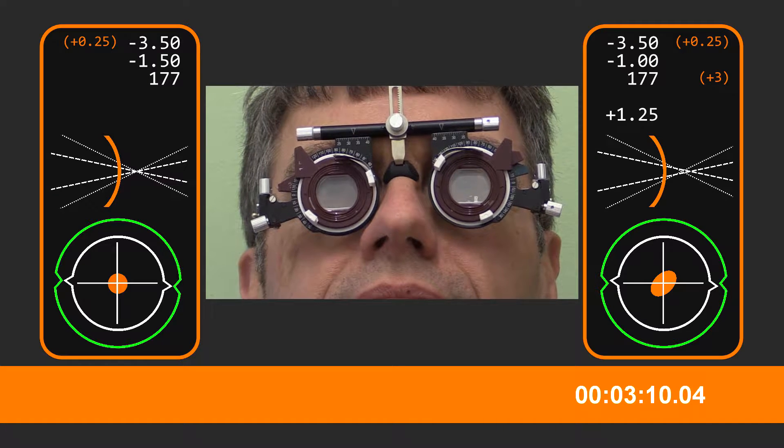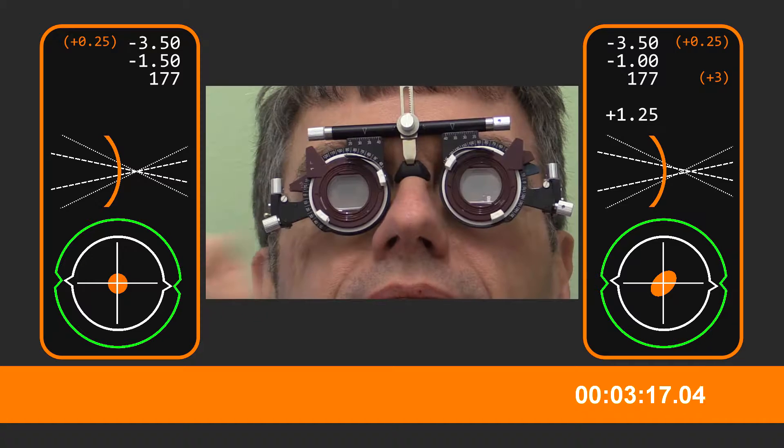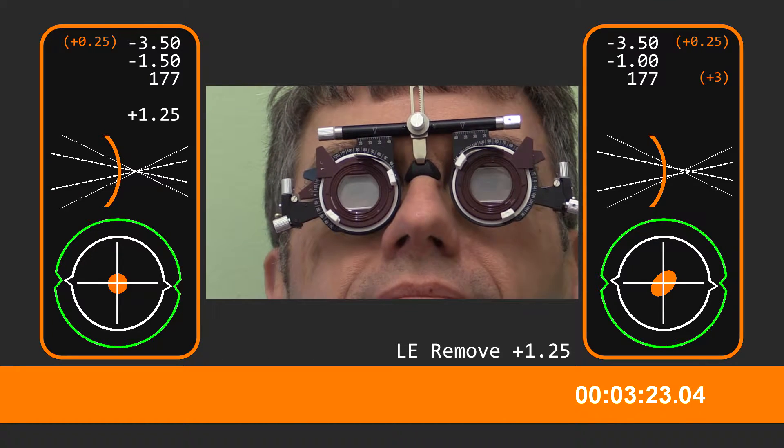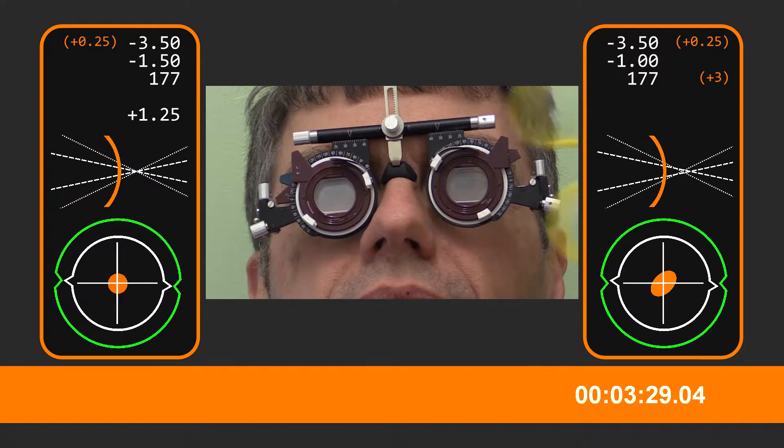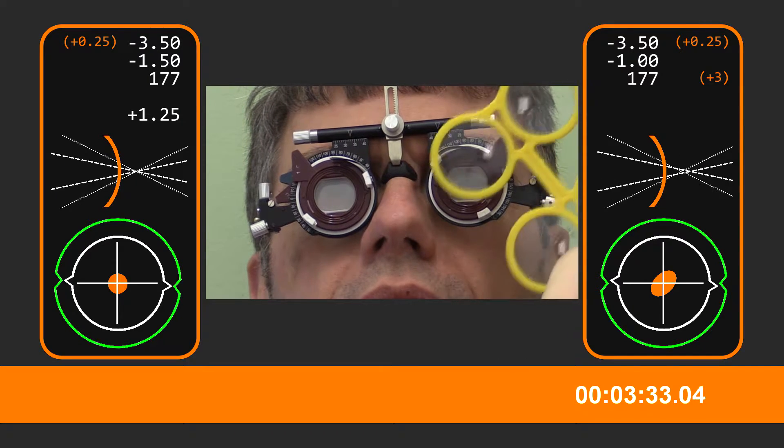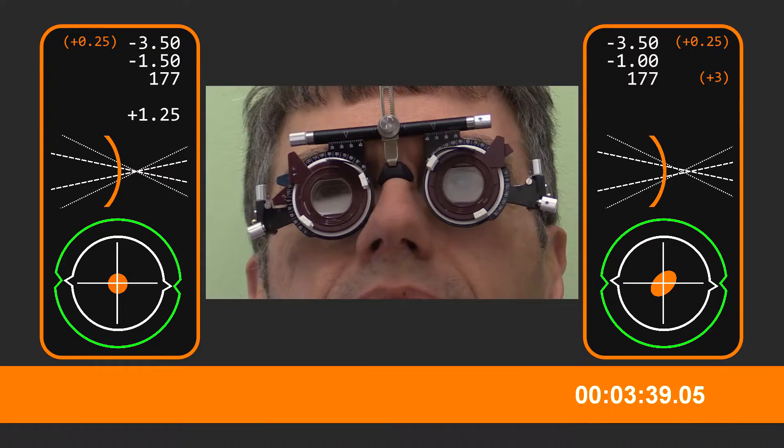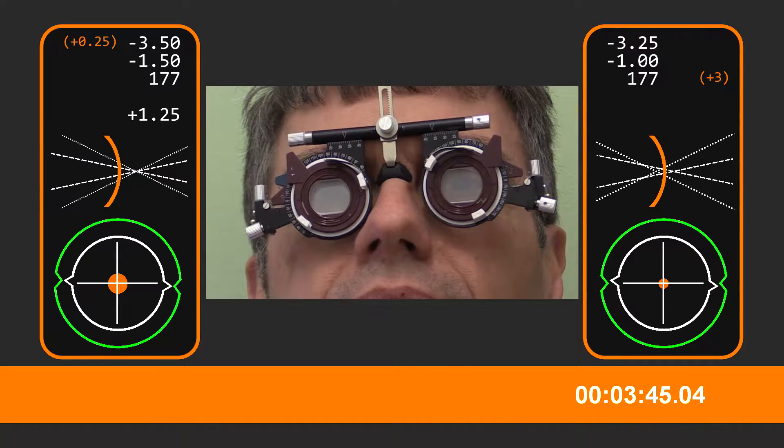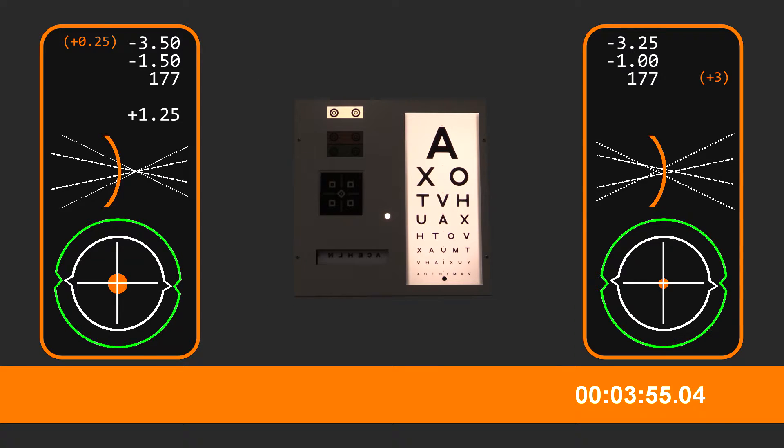And with, without and with. Perfect. Okay, what's the smallest you can see here? Yeah, V-X-M-Y-H-T-U-A. Okay, so we're gonna pop that blurry lens back in front of this eye now. Take it out of that side. Does that get clear again? Yeah. Somewhat clear anyway. And looking at the smallest line that you can see, is it any clearer with or without? With I think. Yeah, with slightly. And clear with, without.